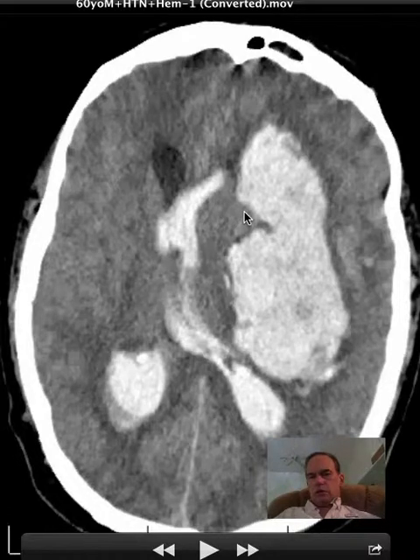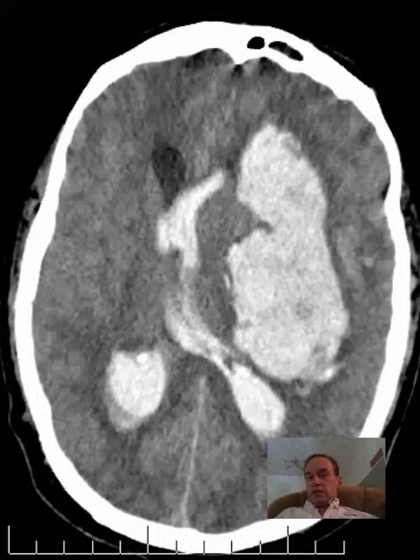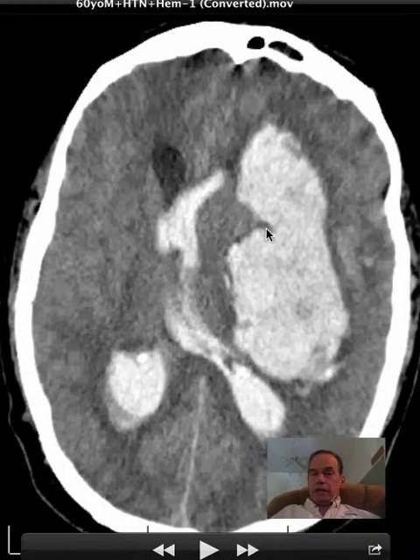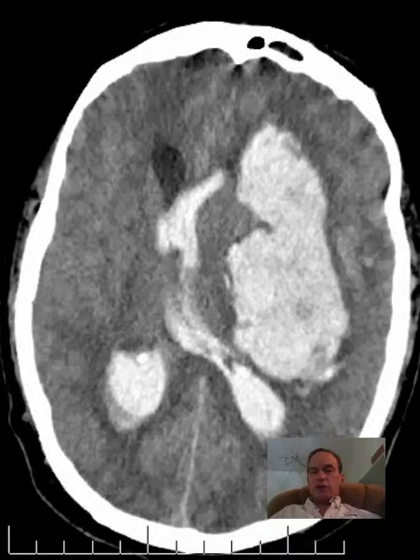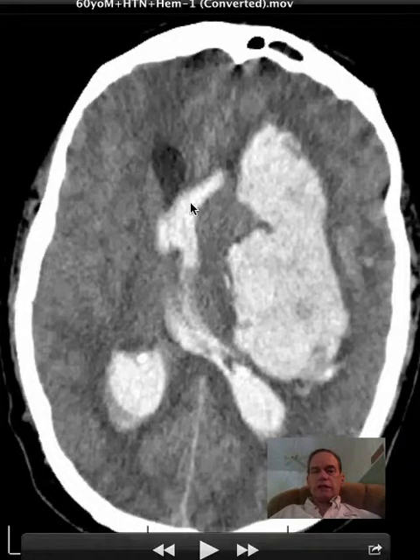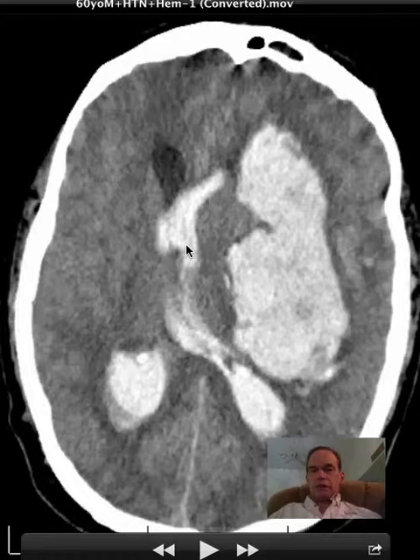Caudate, putamen, globus pallidus — roughly speaking. Hypertensive hemorrhages usually occur in the basal ganglia most commonly, also occasionally in the cerebellum. It is not uncommon when they are large that they extend into the ventricular system, and that's what has happened here. So you have intraventricular extension, and you're defining the left lateral ventricle which is now to the right of midline — so there's significant midline shift.